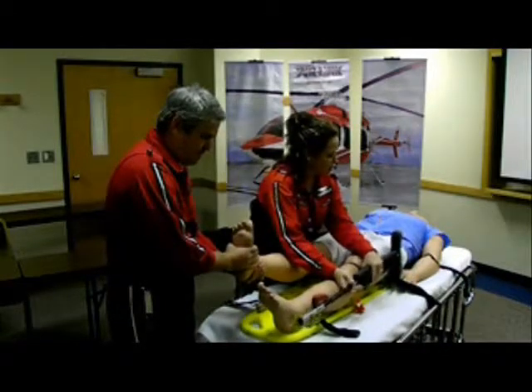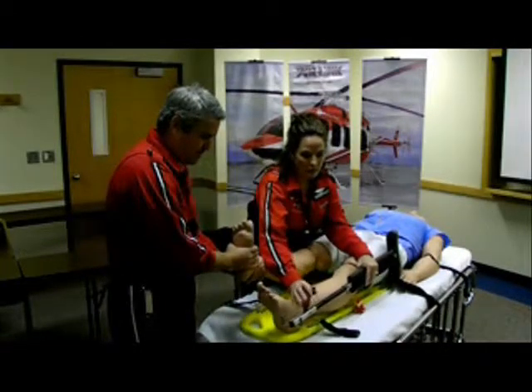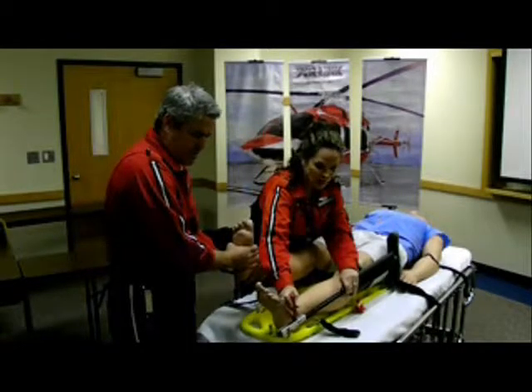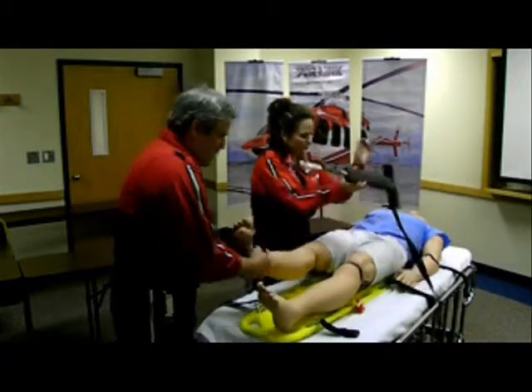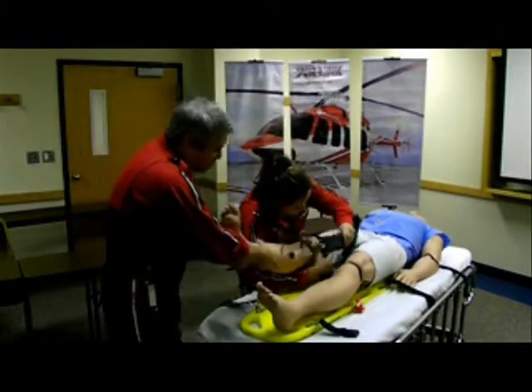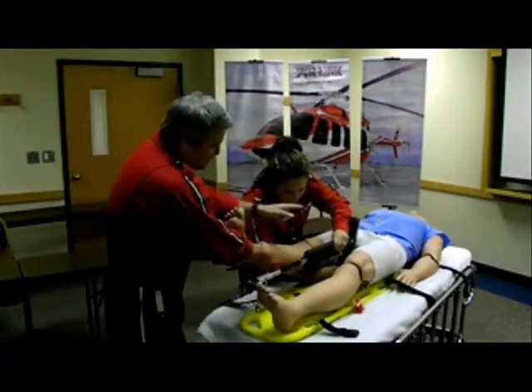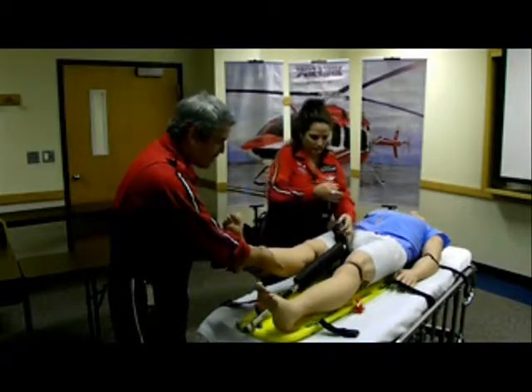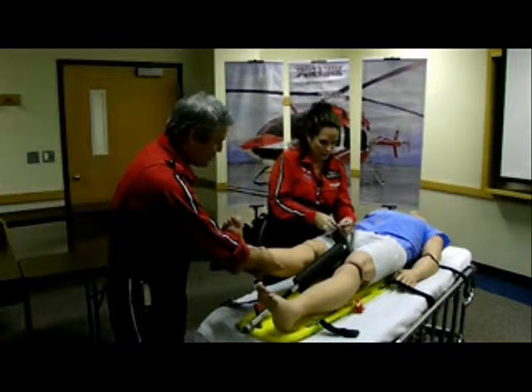Next, place the Sager traction splint to the uninjured leg for proper measurement. Extend the traction splint approximately 4 inches beyond the heel. Now, some of the contraindications of the Sager splint are a pelvic or hip fracture because of the counter traction that the Sager splint is going to apply to the groin and pelvis to provide stabilization.